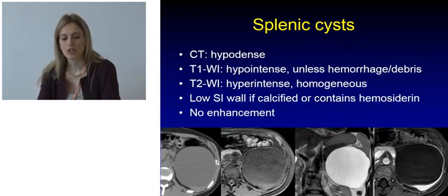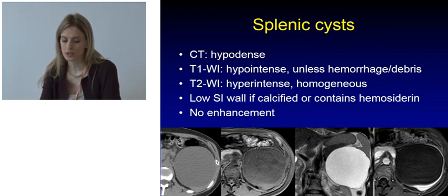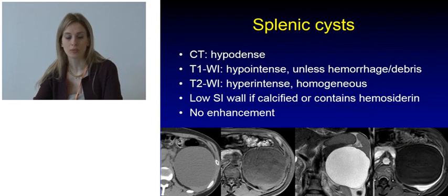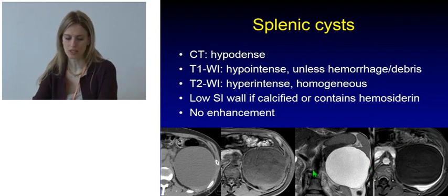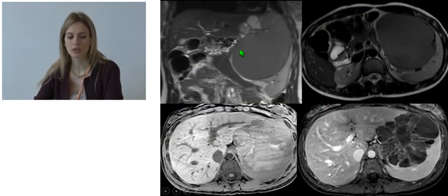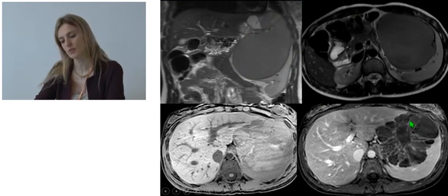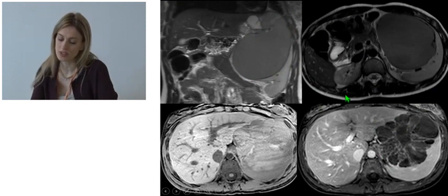On CT, cysts are going to be hypoattenuating. On MRI, they're going to be hypo-intense on T1-weighted images and hyper-intense on T2-weighted images. The wall is going to have a low signal intensity if there are calcifications or hemosiderin. Cysts typically show no enhancement, as we can see in this case of a large unilocular cyst and in this other case of a multi-loculated cyst with varying content in different loculations due to different protein content, with some slight enhancement of the septa.